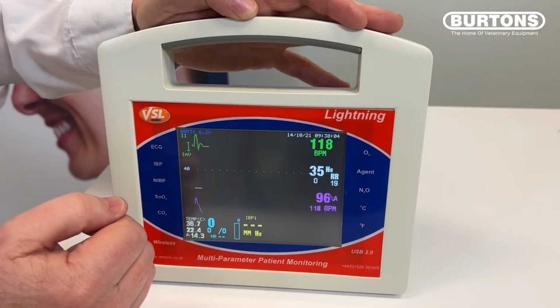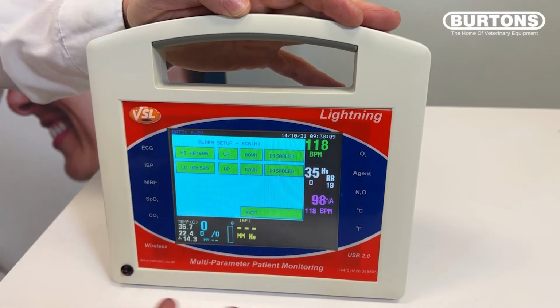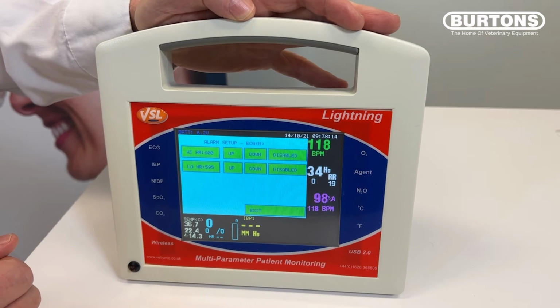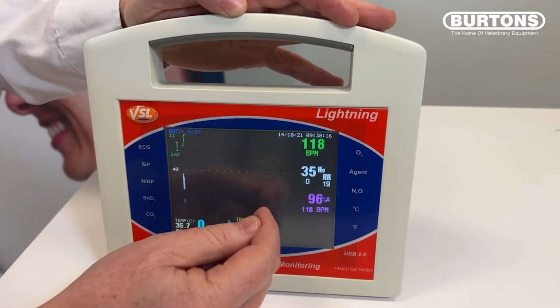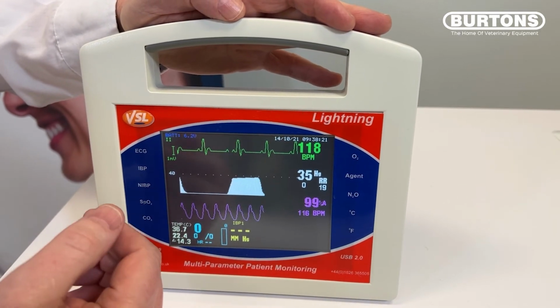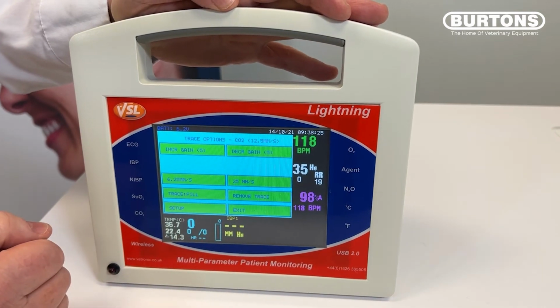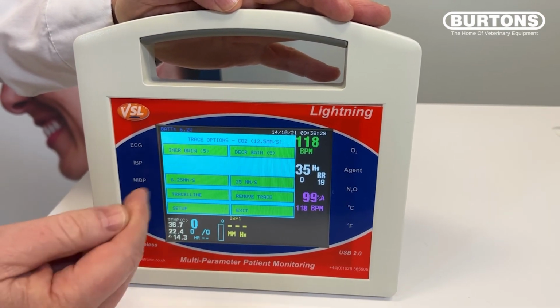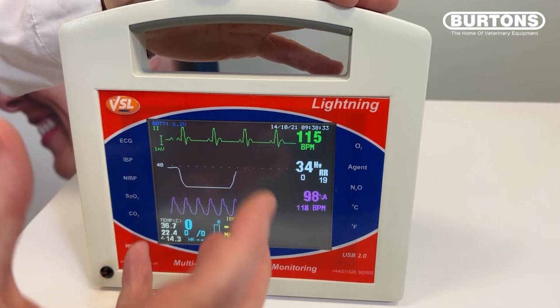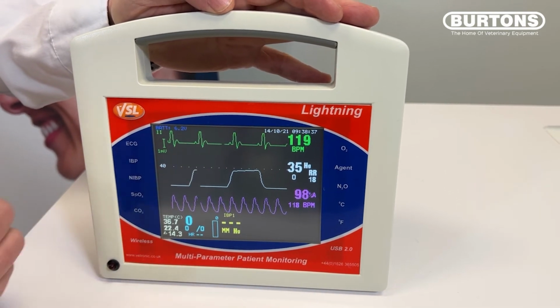If we subsequently touch numbers, for example, if we go into here, then we get the alarm limits for that trace. So here we can set the high and low heart rate limits for the ECG. Some of the other options that you can have are to change the appearance of the trace. For example, with CO2, if we go in here, we can change that from a fill to a line for CO2, which just changes the appearance of the trace. So all of these options and features are available through a very simple one-touch point through the screen.